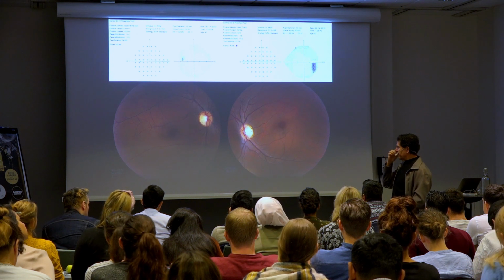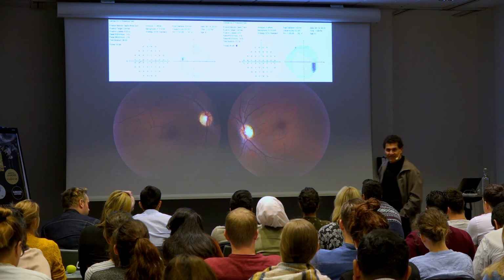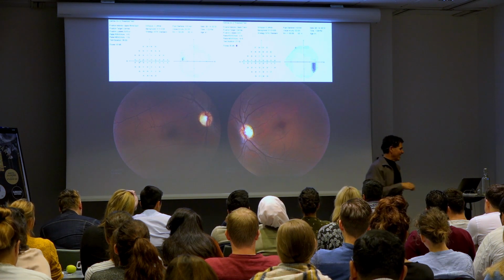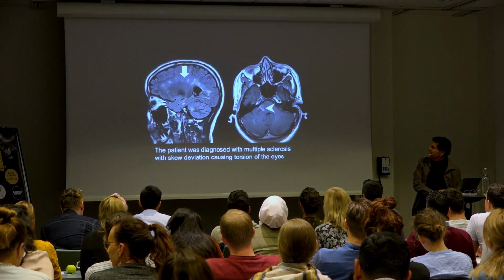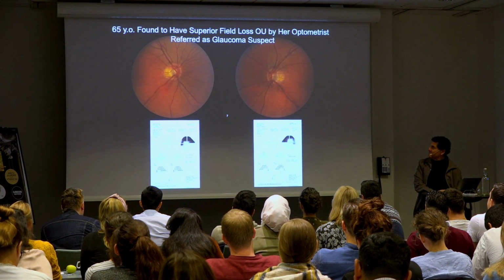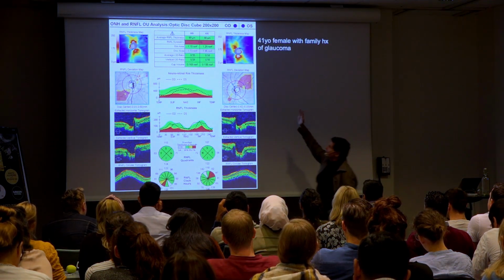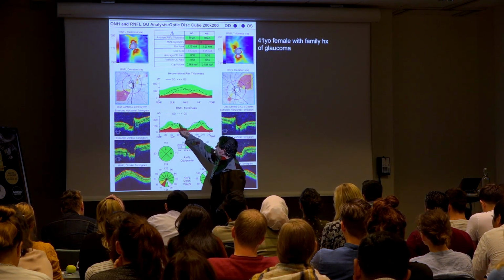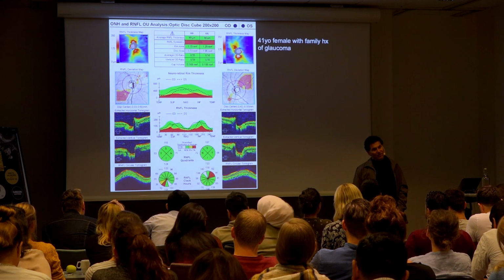And what on the fundus photo accounts for that? Not on the same line. They are not on the same line. Yeah, why aren't they? Slight torsion. That's right. So that person had a skew deviation causing torsion of both eyes. If you go back and look at this again, you see how the bundles are rotated so they're in the wrong location where you're expecting them to be, because the eye's rotated. That can also happen if the person's sitting in the OCT machine tilting their head.